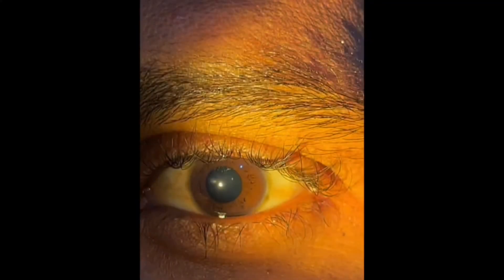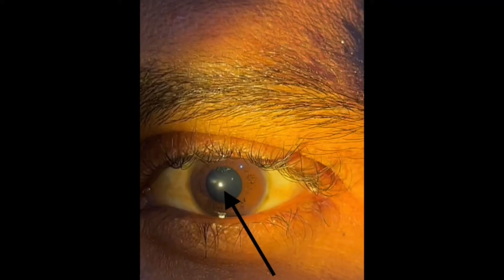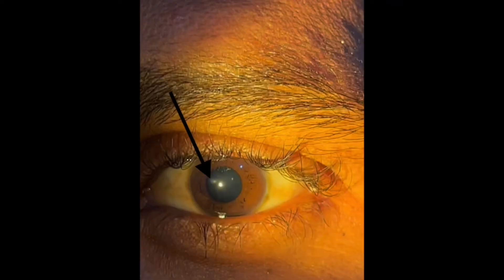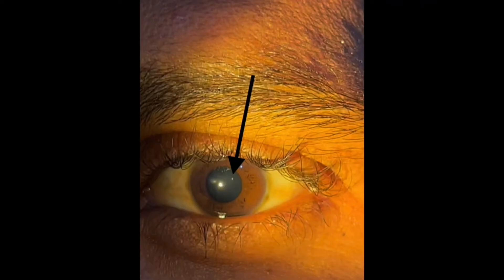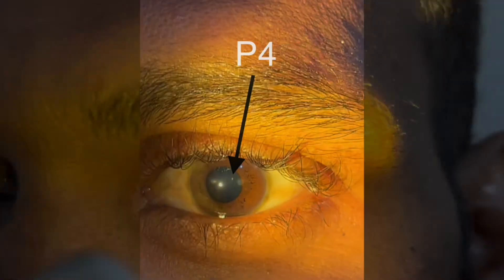Looking at the picture, you will see Purkinje image one reflected from the anterior surface of the cornea. Purkinje image two, reflected from the posterior surface of the cornea, is superimposed on Purkinje image one. Then you see Purkinje image three, which is slightly fainter than the first two. Finally, there is a smaller, fainter reflection which is Purkinje image four.